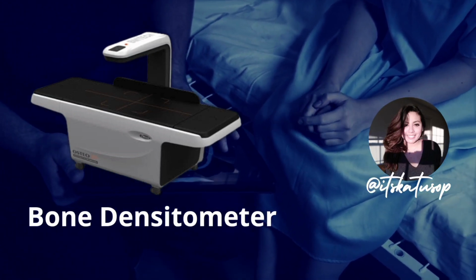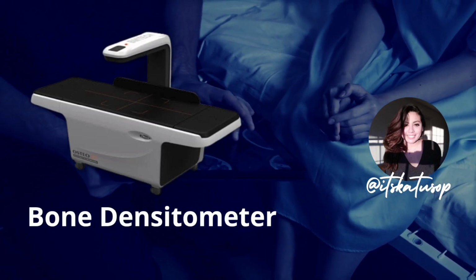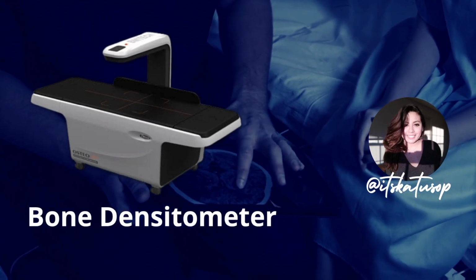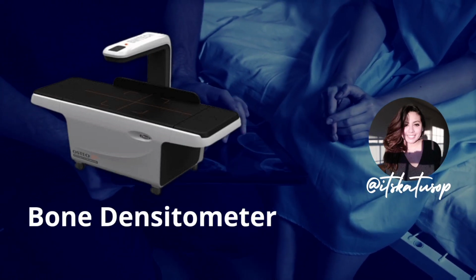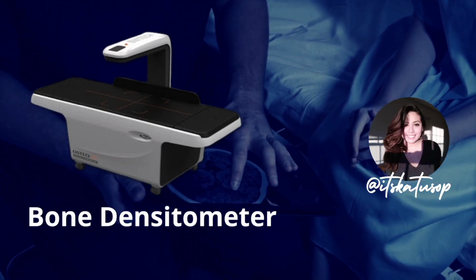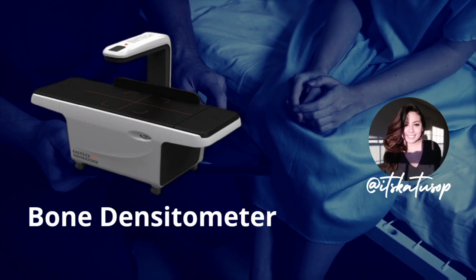Bone densitometry is also known as BMD testing, which is short for bone mineral density testing. BMD testing is commonly used to diagnose and monitor osteoporosis, and it evaluates bone health in other populations at risk for bone loss.